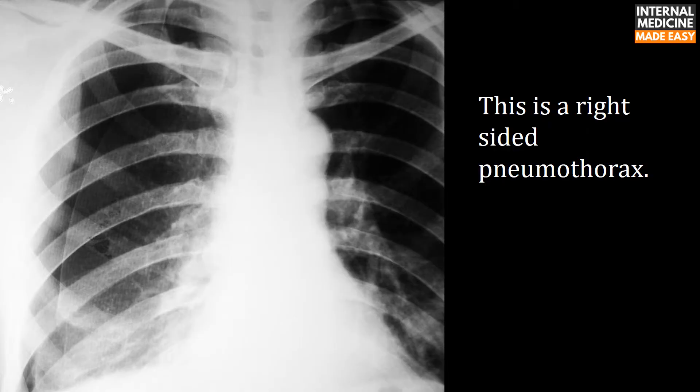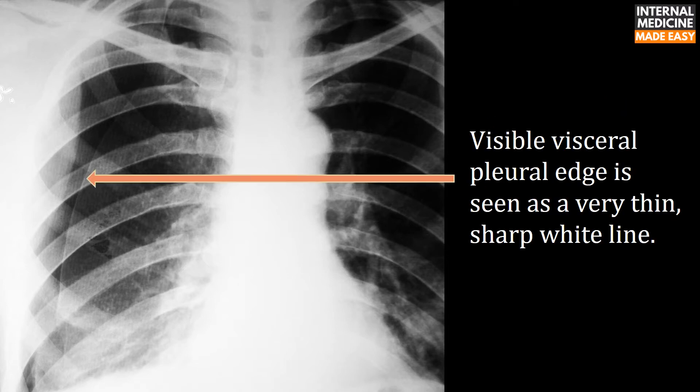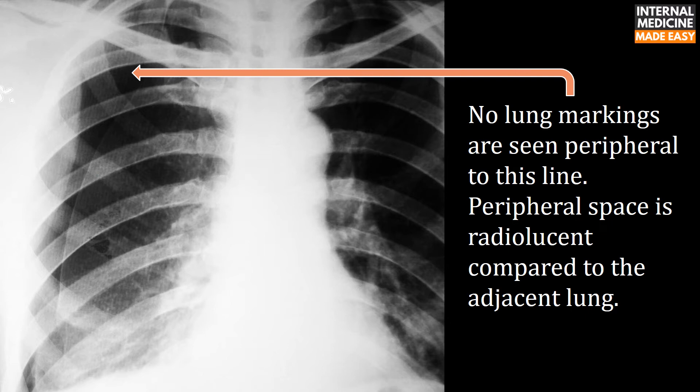This is a right-sided pneumothorax. The visible visceral pleural edge is seen as a very thin, sharp white line. No lung markings are seen peripheral to this line. The peripheral space is radiolucent compared to the adjacent lung.